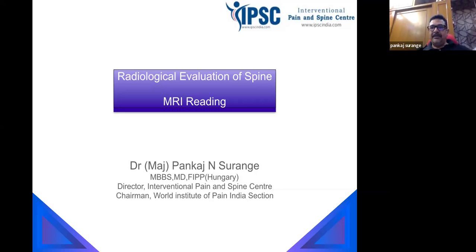So for that, it is important: if you've seen all the reports, wherever you get the reports, it is always mentioned, "please correlate clinically." Why they mention this is because they are reporting on the basis of whatever is visible to them. But as a physician, it is important for us to identify exactly what the source is. There may be multiple pathologies, but since we have examined the patient and know the clinical history, we have to correlate clinically and with the MRI radiological findings what is matching with the patient's symptoms or history. And accordingly, we have to select the intervention.